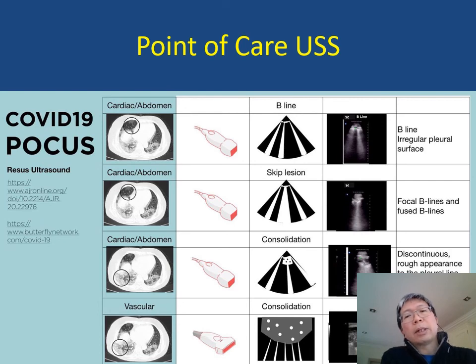Lung ultrasound is now gaining greater acceptability amongst ED and respiratory physicians in the assessment of early COVID-19 infection. The ultrasound has the added advantage of being able to be performed by the patient's bedside with no additional radiation exposure, both to staff or the patient. In addition, serial imaging allows for close monitoring of patients at risk of deterioration.